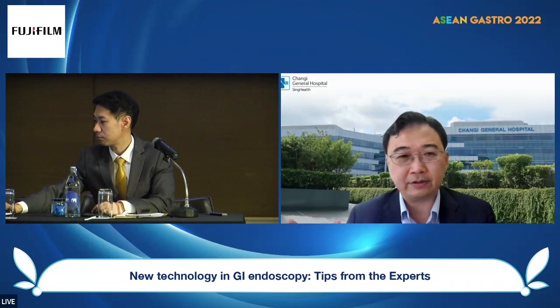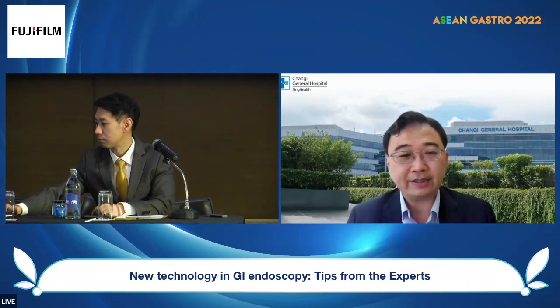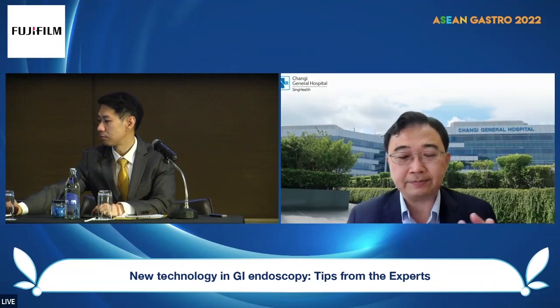So first of all, I think as endoscopists, we need to be quite resourceful. Be it chromoendoscopy or IEE, all these are actually tools for us to use to do our job better. Hence, in different circumstances, one may be better than the other. For instance, if we want to do an endoscopic resection for, let's say, esophageal squamous cell neoplasia, we can actually see the margin quite well with IEE, and we can mark the lesion.